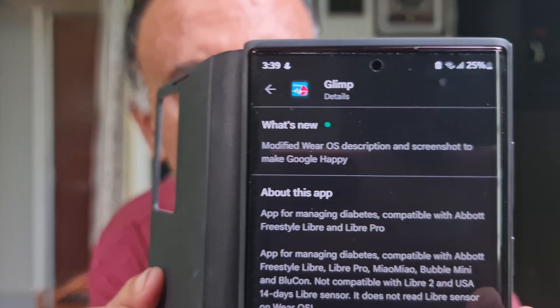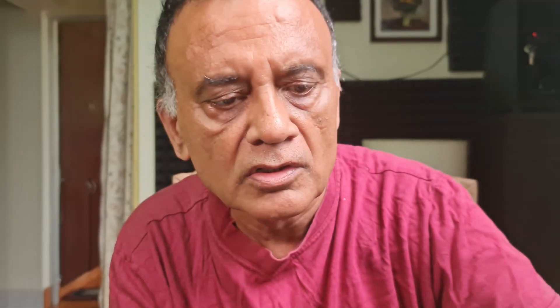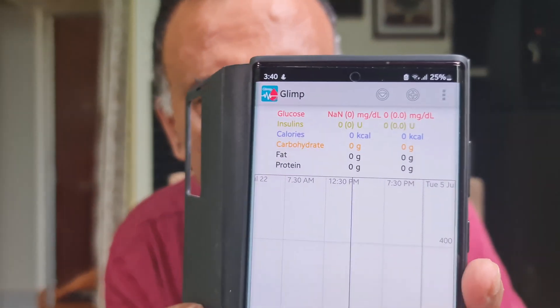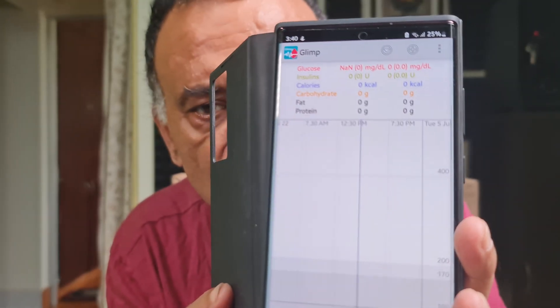Now, the Glimp app has been installed and I am going to open it, accept the conditions. This is the interface which you are presented with when you open the app for the first time. It is a sort of a tabular structure but don't be confused by all this — it will do the job.